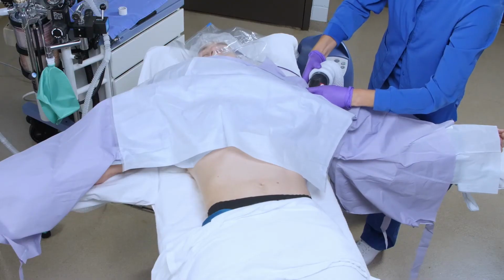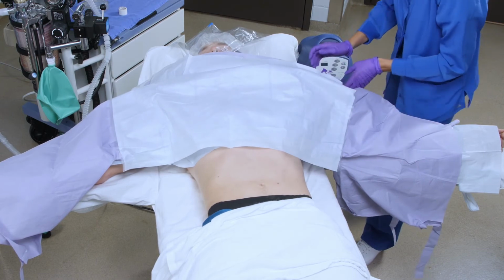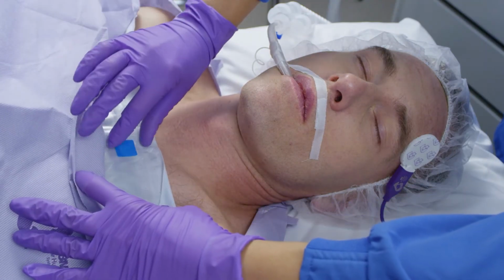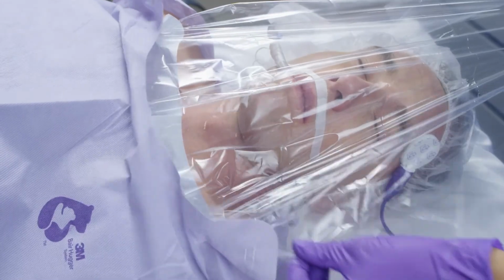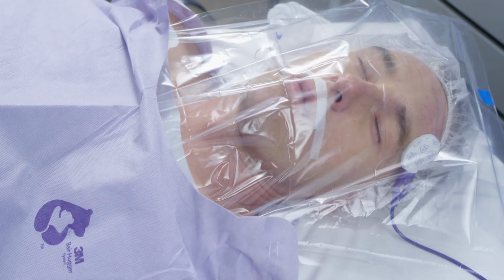Remember, at least one arm of the upper body insert must be deployed if you choose to use the upper hose port. There is also a head drape that can be deployed in intubated patients. The drape is easily identified by a blue dot found between the gown neckline and the upper body insert.